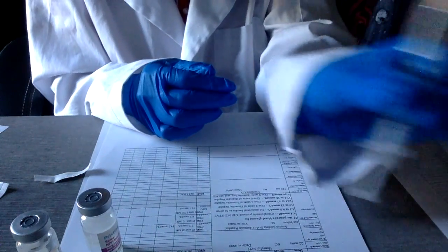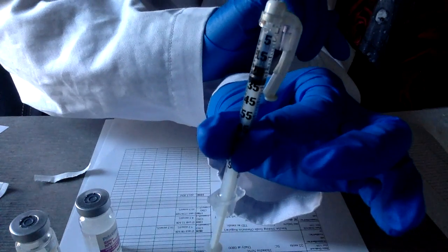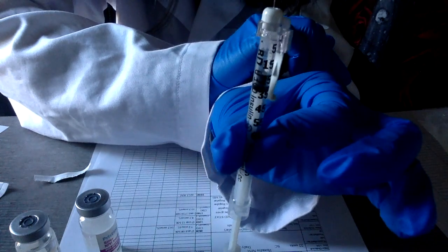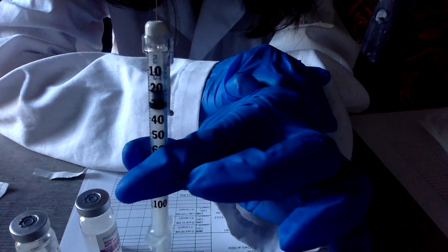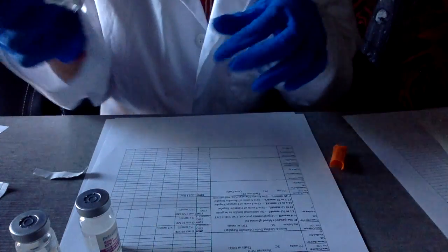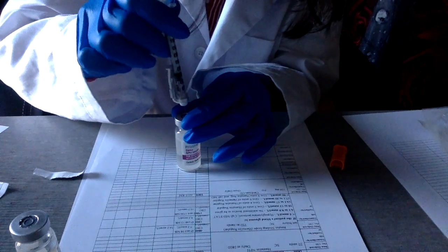All right. This is hard. Okay, 20 units of air, and you would inject that into the Humulin N.